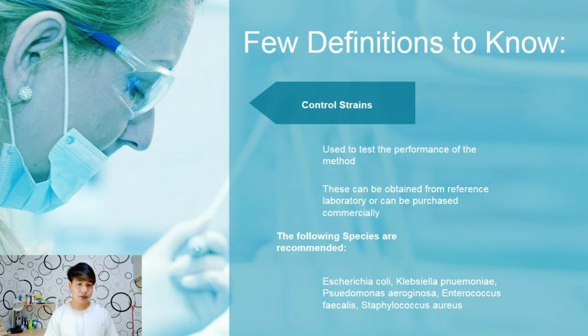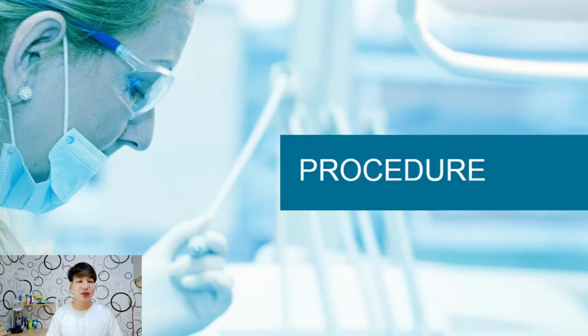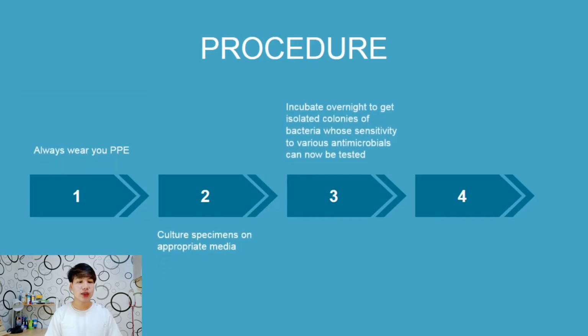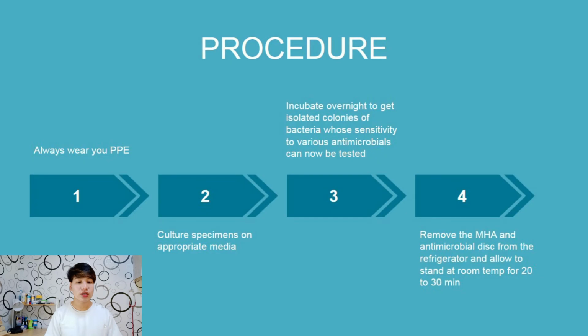For the procedure, always wear your PPE, culture specimen on appropriate media, incubate overnight to get isolated colonies for testing, remove MHA and antimicrobial disc from the refrigerator and allow to stand at room temperature for about 20 to 30 minutes. Refer to the following video for the procedure.